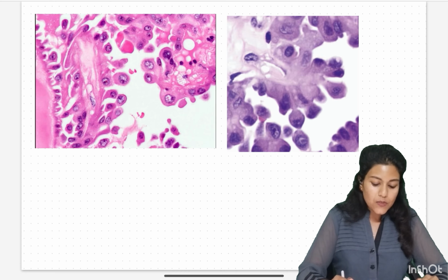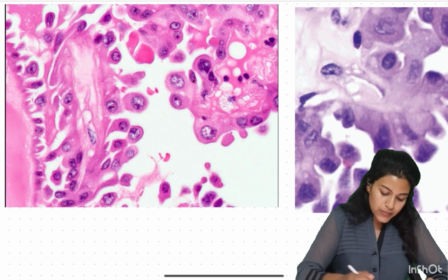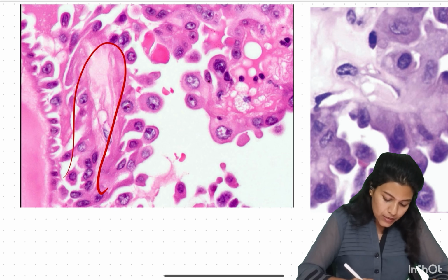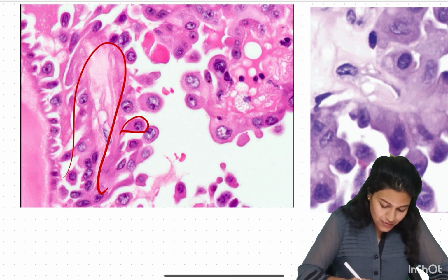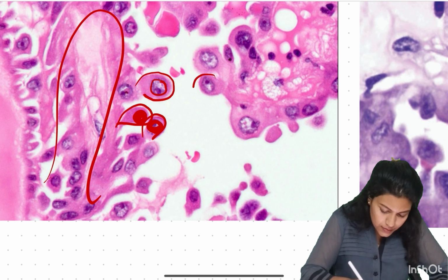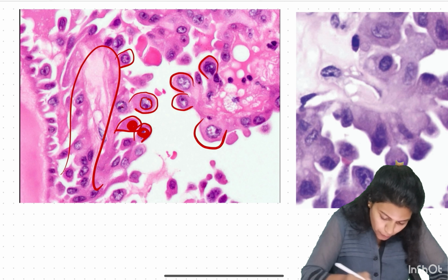So these are the histopathology images. Here, what we see clearly from the slide is there are papillae. Here there are cells with apical snouting. The nucleus is apically located. The cells are bulging out into the lumen. So typical hobnail cells are visualized. These are the hobnail cells.